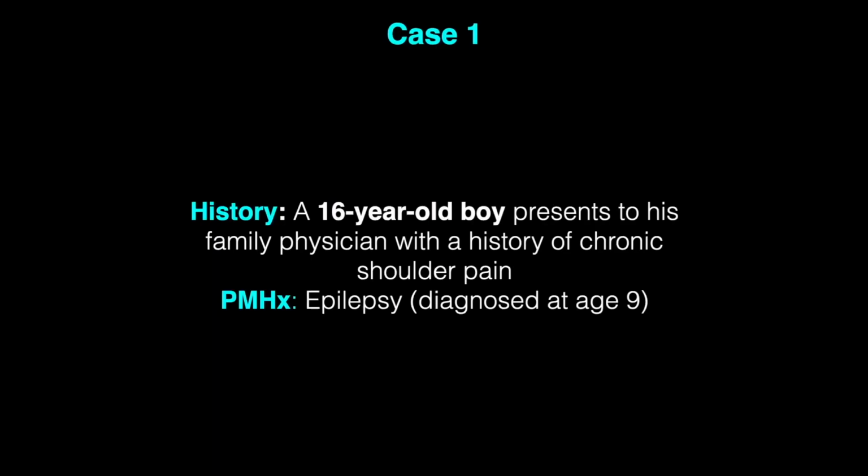Now let's look at a case. Here we have a 16-year-old boy presenting to his family physician with a history of chronic shoulder pain. He has a past medical history of epilepsy diagnosed at age 9.